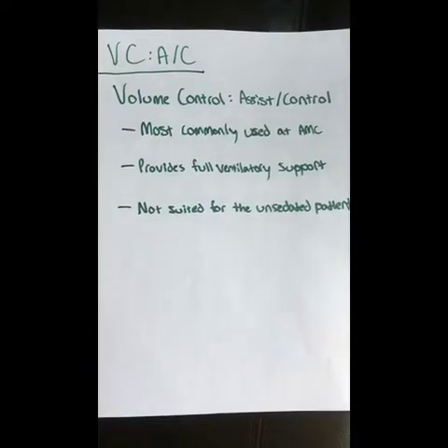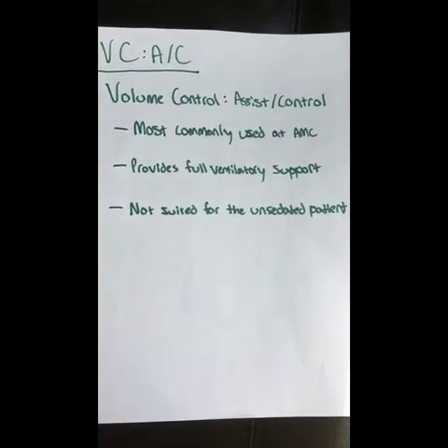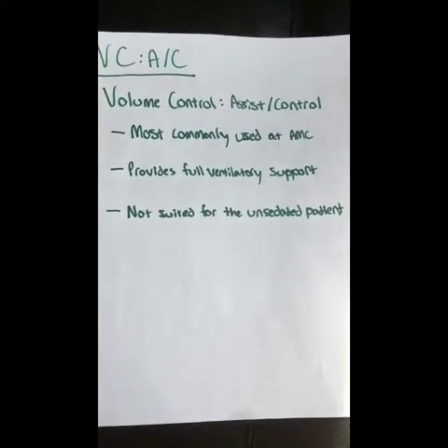We'll start with volume control modes of ventilation, and the first one we'll talk about today is the one that's most commonly used, assist control. The big things to note about this mode is that it is number 1 most commonly used at our hospital, does provide full ventilatory support, and may not be suited for the unsedated patient.